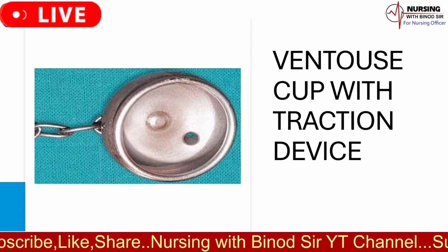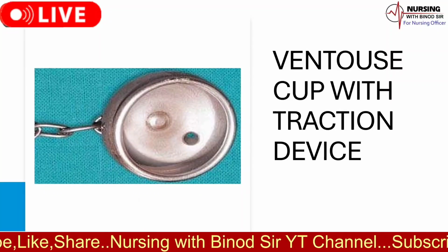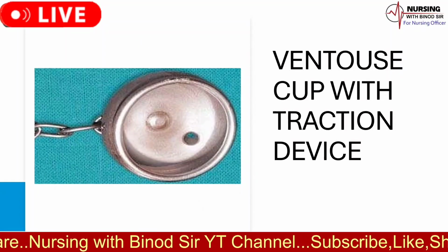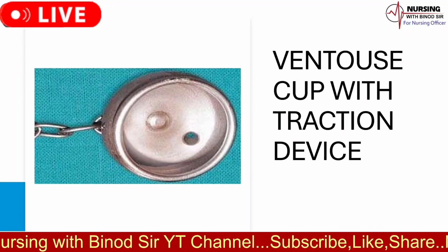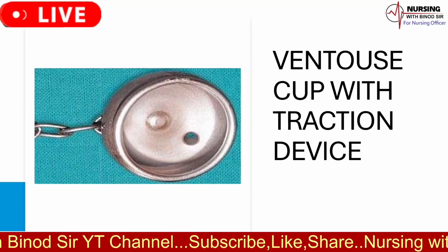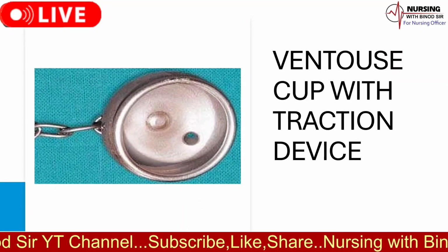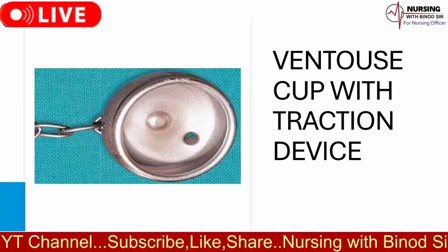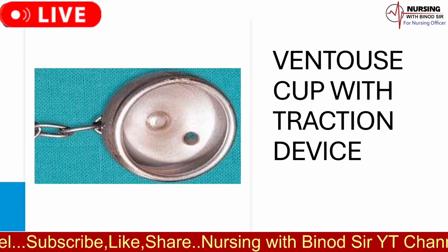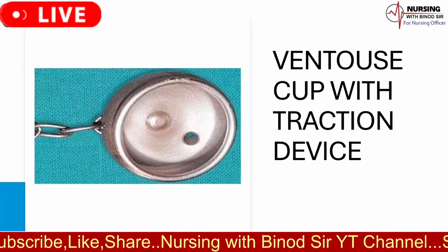2. Prolonged labor. It is beneficial during prolonged labor to expedite the delivery without resorting to caesarean sections. 3. Malpositioned fetus. The ventouse cup can help in deliveries when the baby is in a less than ideal position, such as the occiput posterior or occiput transverse positions. 4. Reducing maternal exhaustion.